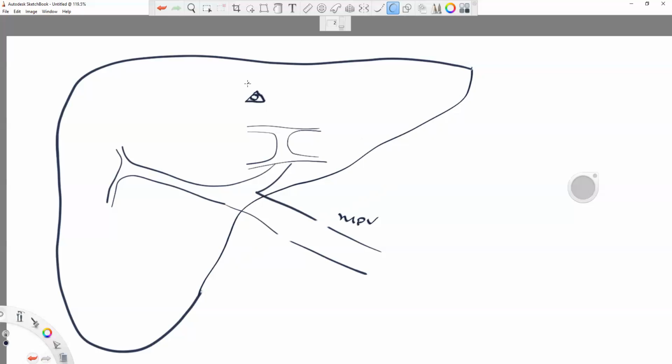If not, you might see just a little something else that's not quite a triangle. Depending on your angle, you might see something that seems like it's coming off the head, this missing head of this little man. You might even see this like that. And of course, whether it's a triangle or a little more straightened out, echogenic ligamentum teres, that is the ligamentum teres.